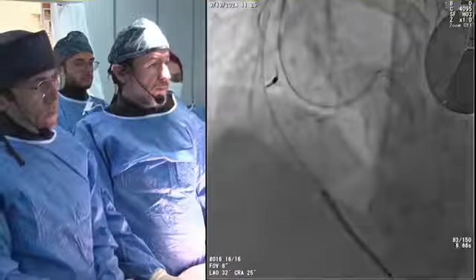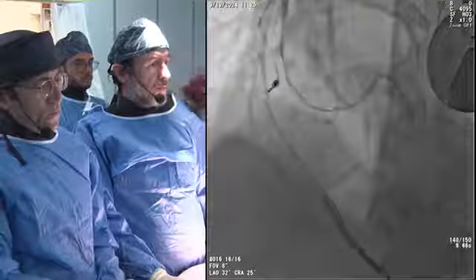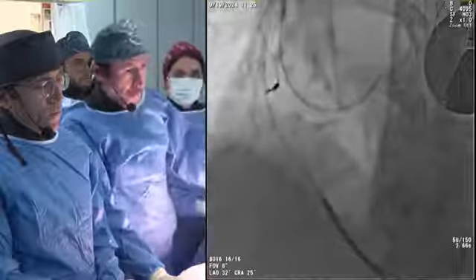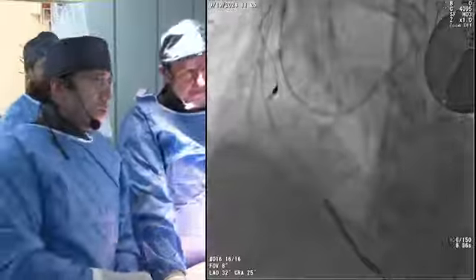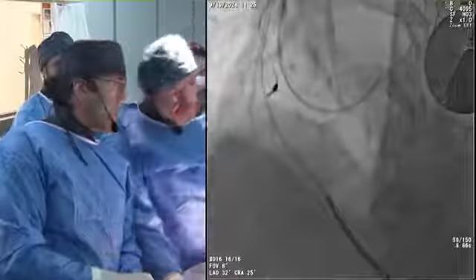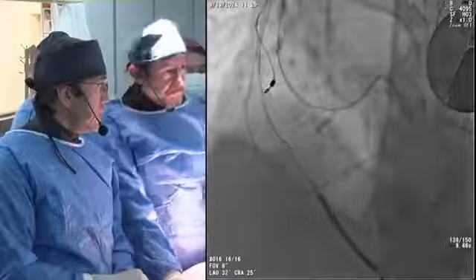And may I ask panelists if you have any comment about this case? Dr. Tarek or other panelists. Şevket abi, kolay gelsin. At this moment, try to carry the retro microcatheter as far as you can to the proximal part, and some Carlino could help us.